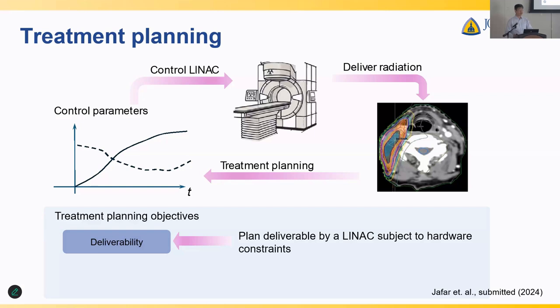For example, how fast the machine can move at the most, how fast some component of the linear accelerator can respond to certain changes, etc. So there's a long list of requirements about the deliverability.